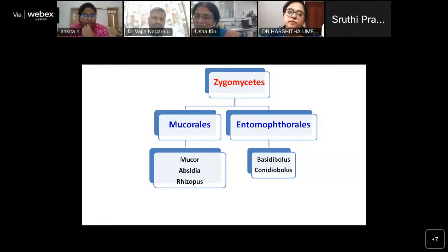No, ma'am. In mucor, you would see filaments. You don't see that much of splendore-Hoeppli, ma'am. Yes, splendore-Hoeppli, right? They are distinct, and you can really see the stem of the hyphae. How do you describe the hyphae in mucor? Non-septate, ma'am. Right. Non-septate. All those things you can really appreciate.